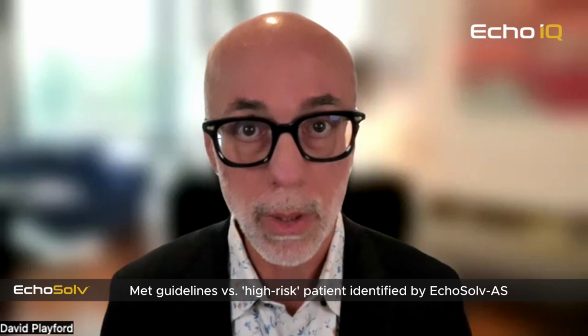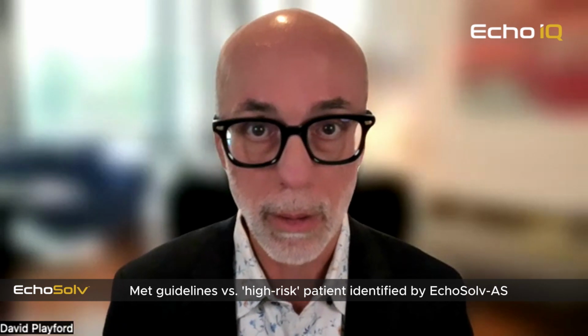Severe aortic stenosis using guidelines is what you already know well, which is the three criteria of a peak velocity greater than or equal to 4 meters per second, a mean gradient of greater than or equal to 40 millimeters of mercury, and/or an aortic valve area less than or equal to 1.0 square centimeters using the continuity equation. So that's the guidelines, and obviously there's more to making an assessment in guidelines than that.